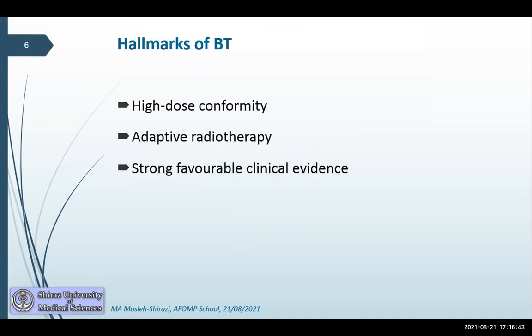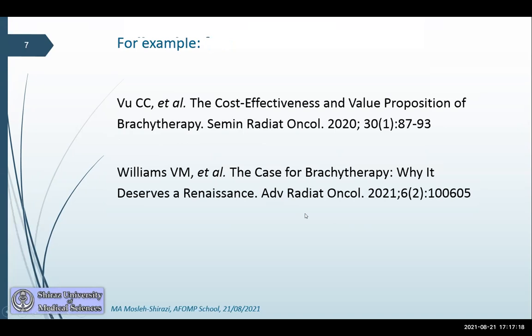So why brachytherapy at all? Well, hallmarks of brachytherapy are that the high dose is very conformal. It has adaptive radiotherapy inherent in it, and there is strong favorable clinical evidence for brachytherapy. So these are the sort of things that might say, in the 21st century, we talk about advanced external beam radiotherapy techniques like VMAT, et cetera. For people who would like to read more about the reasoning and the rationale for brachytherapy, I suggest these two papers from 2020 and 2021, for example.